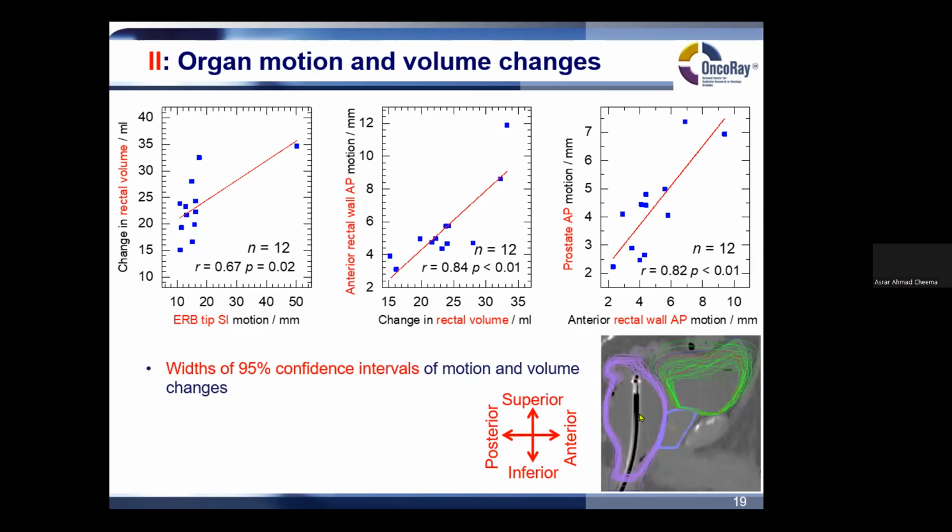So when the largest part of diameter was neighboring the prostate, at that time the volume of the rectum was largest, and when it is too far inserted or too less inserted, then the volume neighboring the prostate was changed due to the insertion variation of endorectal balloon.